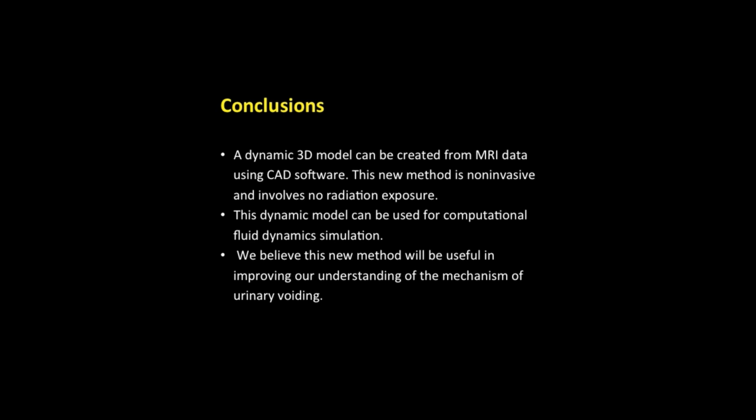In conclusion, a dynamic 3D model can be created from MRI data. This new method is non-invasive and involves no radiation exposure. This dynamic model can be used for computational fluid dynamics simulation. We believe this new method will be useful in improving our understanding of the mechanism of urinary voiding and voiding dysfunction.